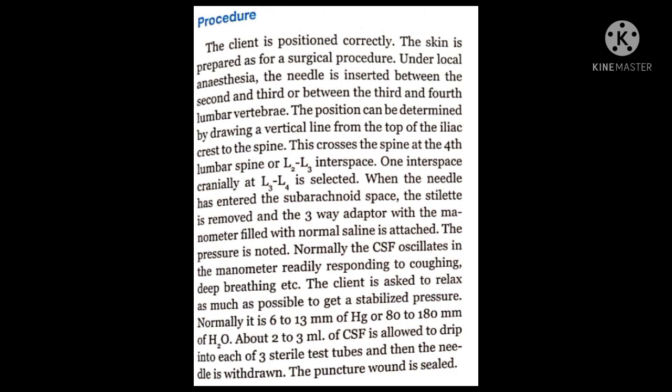About 2 to 3 milliliters of CSF is allowed to drip into each of 3 sterile test tubes and then the needle is withdrawn. The puncture wound is sealed.